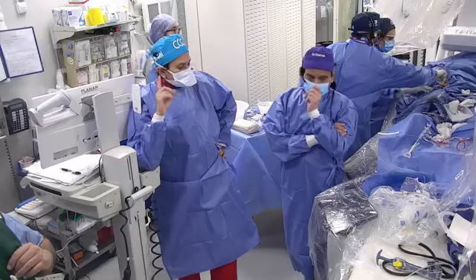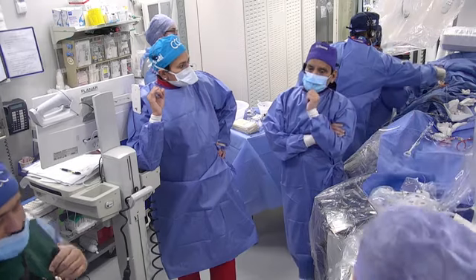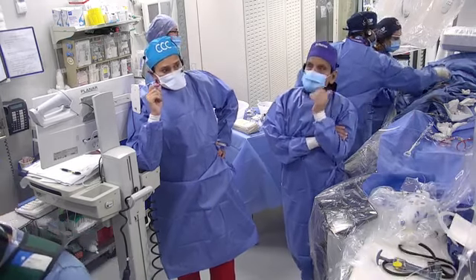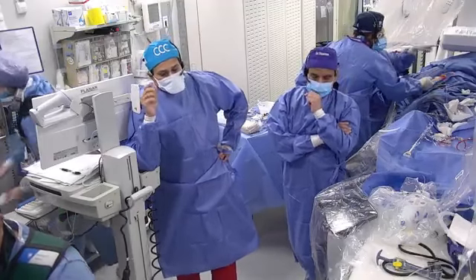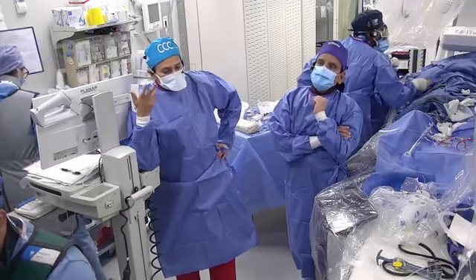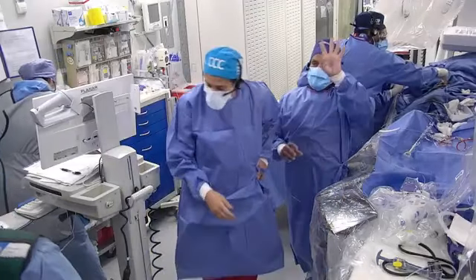In our experience, laser was approved mostly for ISR. Especially if you think it's a chronic total occlusion, where your CTO wire has crossed the lesion and now you cannot get any other wire down, then laser is very helpful. You can do one run of laser and then decide whether you want to upgrade to a second ablative device, which is rotational atherectomy.